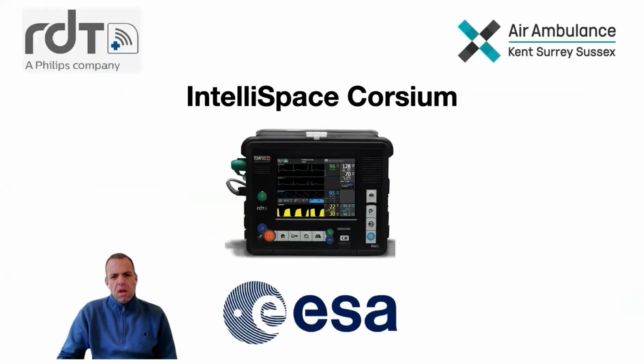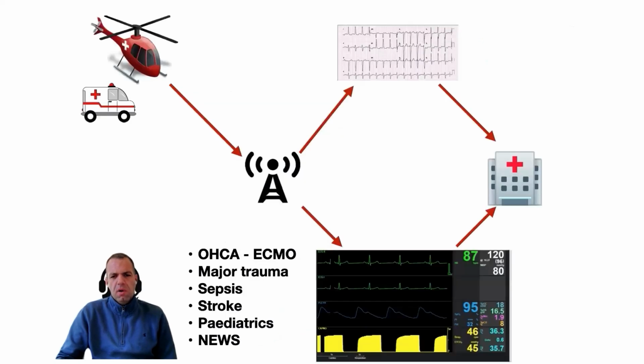That's pretty familiar. What we did with RDT and Philips, and actually generally supported by the European Space Agency, was to introduce a system called IntelliSpace Corsium. Now, what IntelliSpace allows us to do is stream that data almost in real time. There's just a few seconds delay from a Tempus monitor out there in the field somewhere to essentially anywhere we like, because we're sending it to a web server. So why is this useful? Why might you want to think about it? Same concept. We can send the snapshot data to the hospital, but we can also send a literally live screen of Harry and his physiology to the hospital if we wanted to.